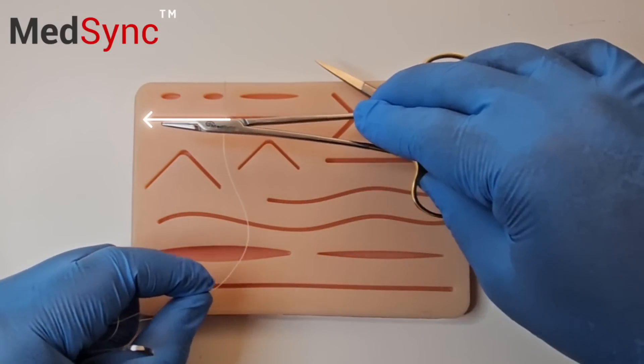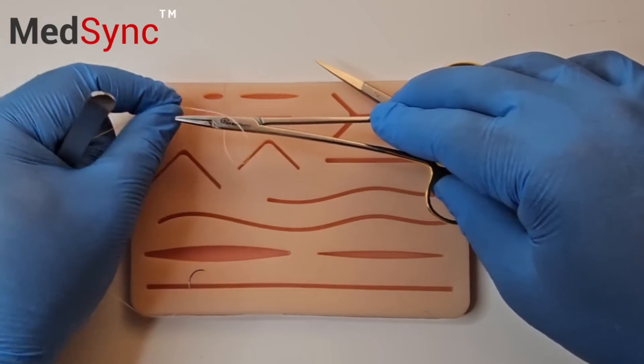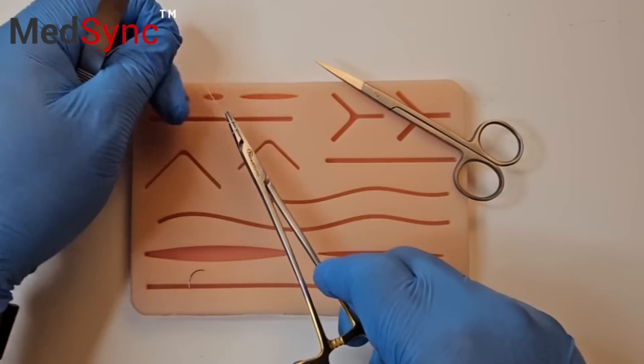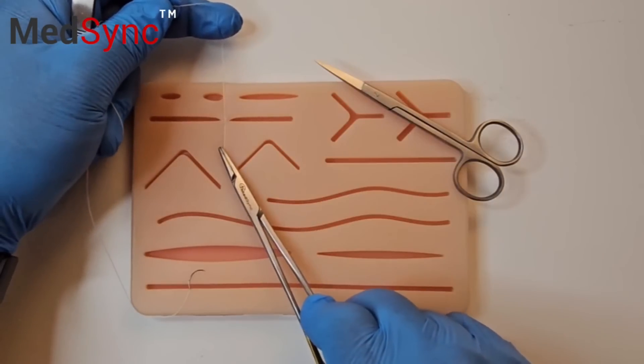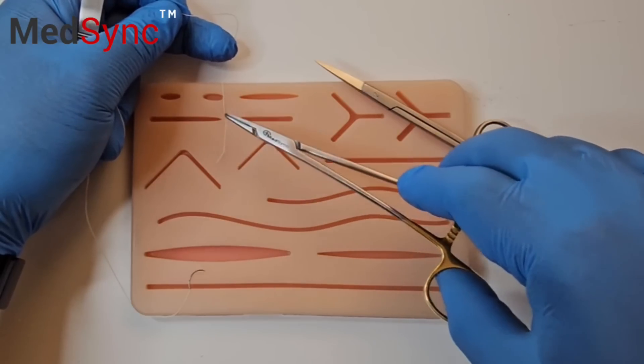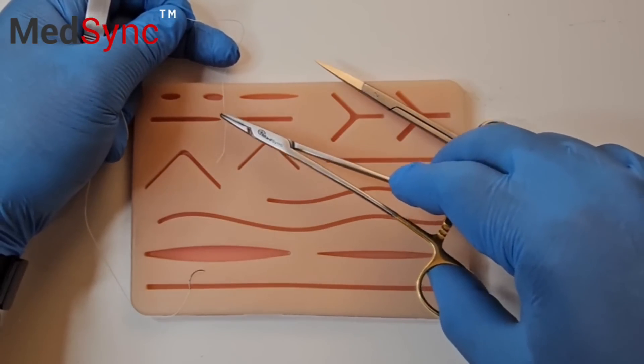Lay your needle holder in between the two. You wrap towards the short suture, grab the tip and pull towards you. The suture ends must alternate each knot. Two revolutions around the needle holder is the surgeon's knot.